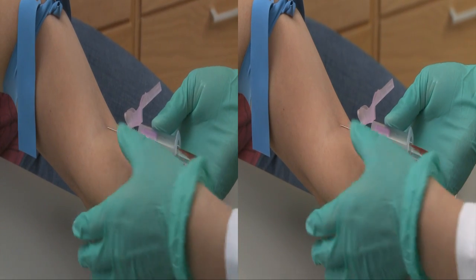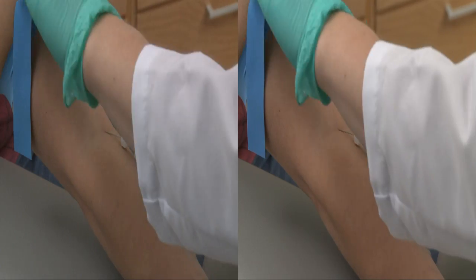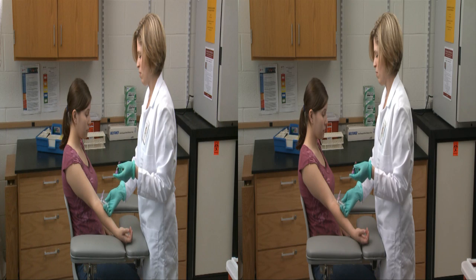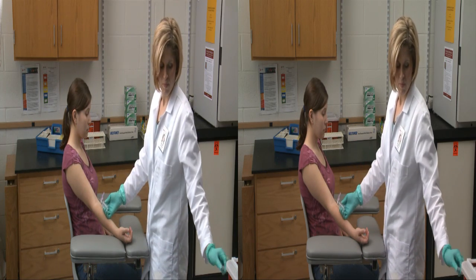As soon as blood begins to flow into the collection tube, instruct the patient to open his hand and remove the tourniquet from his arm. Removing the tourniquet allows the blood to return to its normal rate of flow through the vein and helps reduce bleeding at the puncture site. A gentle mixing by inversion, at least eight times, is required to ensure that any additives in the tube are incorporated into the blood sample.